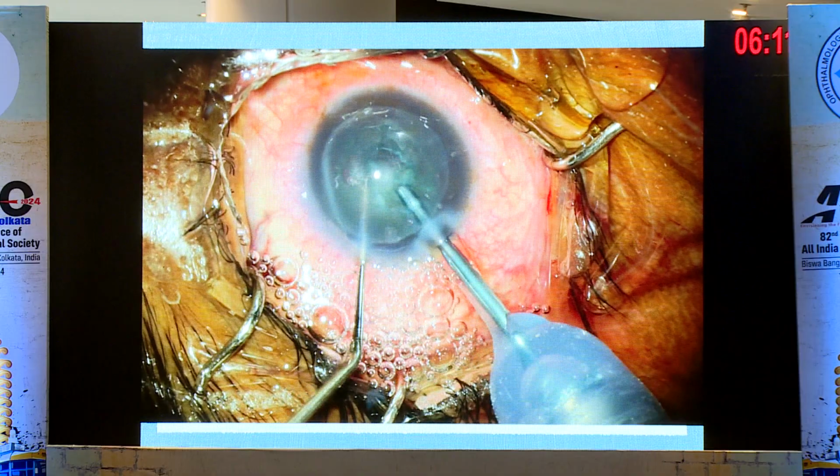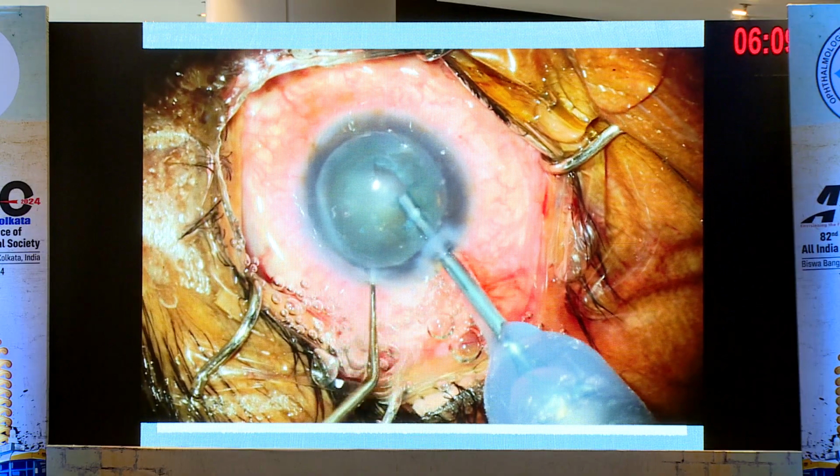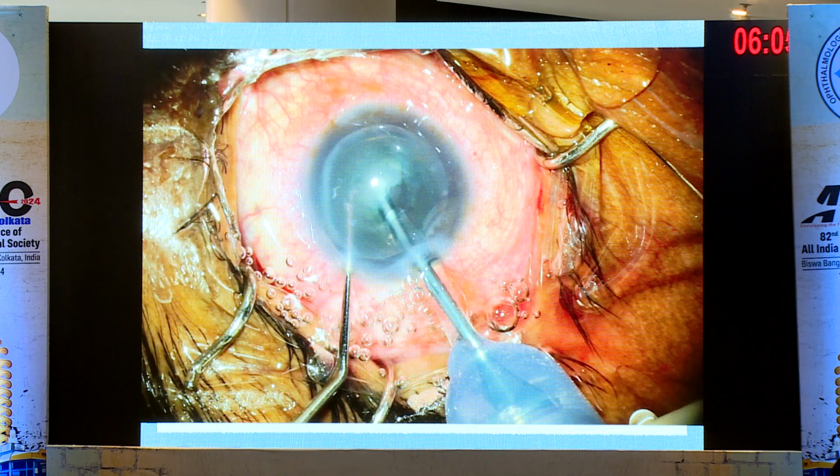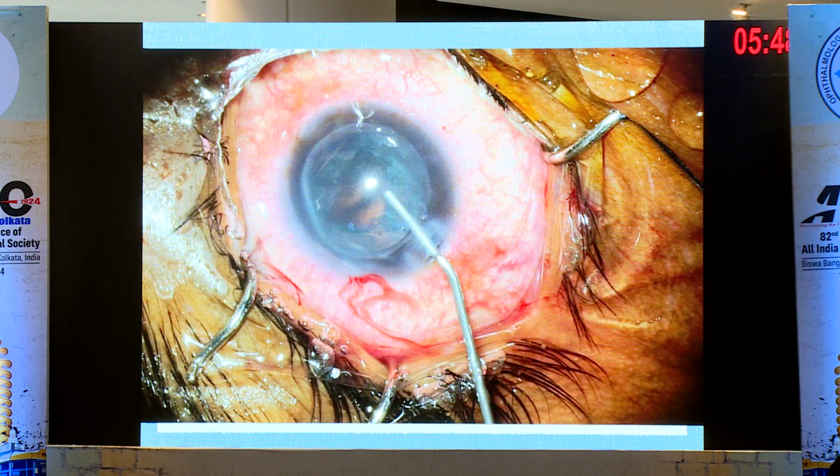Try to direct your phaco tip away from the endothelium, so you might want to either face it downwards or sidewards, and every time you're introducing your phaco probe, try not to go in with irrigation on. Sometimes the flow of your irrigation can also detach the edge of the graft, which is something you just don't want to end up with during a phacoemulsification in a post-DSEK eye.